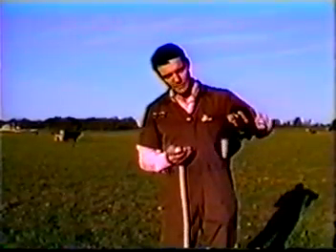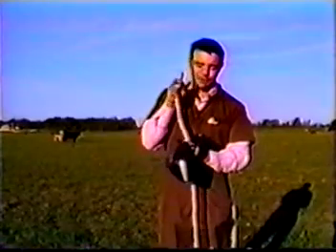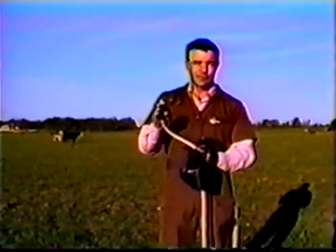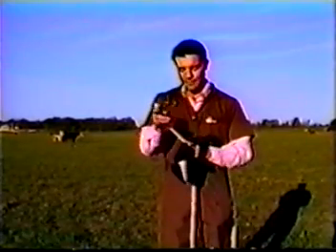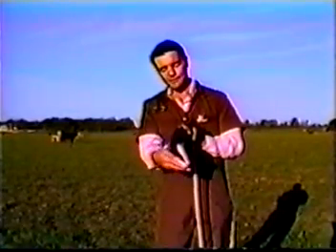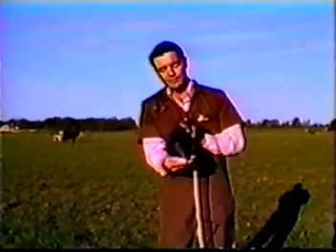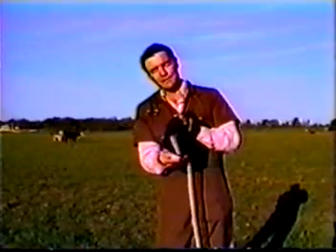Now we have a plastic water bag here that will simulate about a 65-day pregnancy. First, I go into the rectum again with my transducer along the index finger, and once I get into the tract, I like to go down under the tract if I can. If I get under the tract, just by gravity, the fetus is going to fall down to the probe.